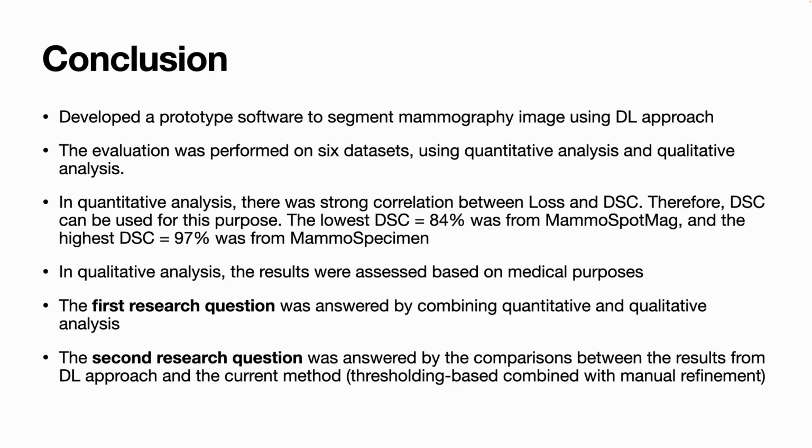Okay, coming to the conclusion. To conclude, this thesis developed a prototype software. This software applies the network to perform the segmentation task on mammography images. The evaluation was performed on the datasets using both quantitative and qualitative analysis.